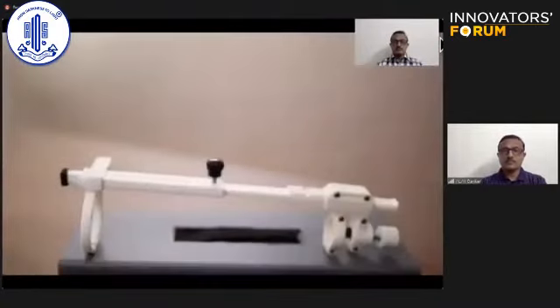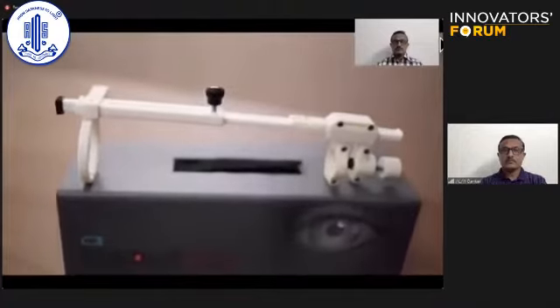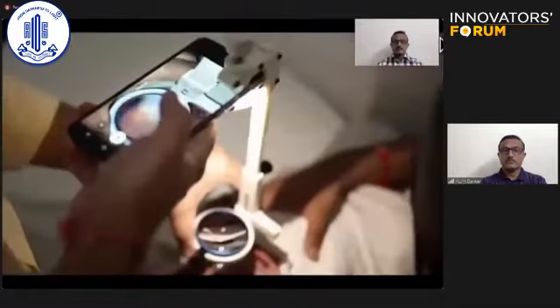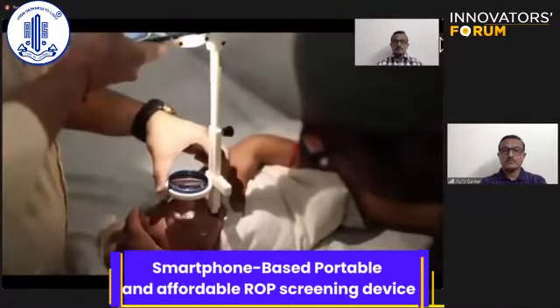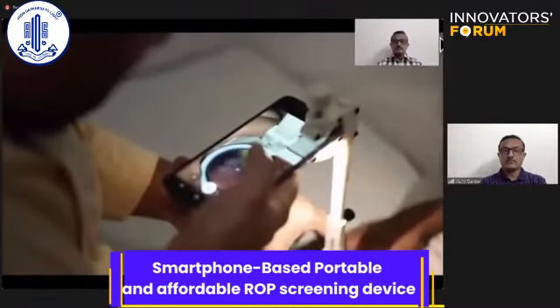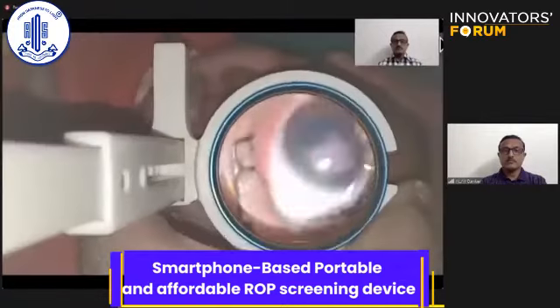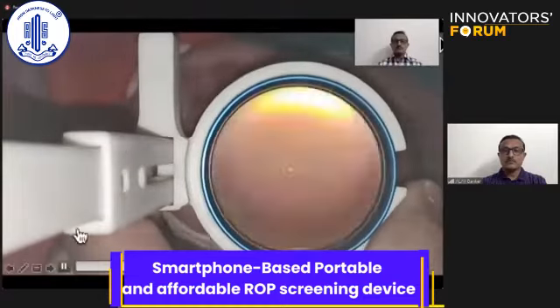The device is very intuitive and easy to use and requires very minimal training. The flashlight of the smartphone is the source of light for conducting the screening. Locate the red reflex of the dilated infant on the screen of the smartphone. The user has to move the lens ring towards the smartphone to capture fundus data as per the working distance of the indirect lens used for screening.